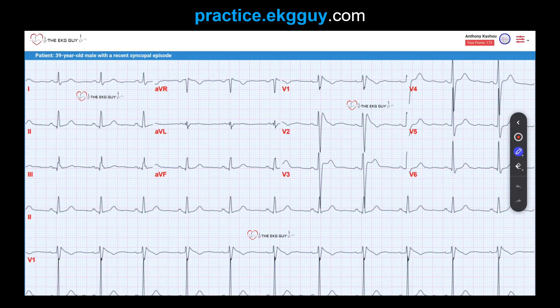So here we have an ECG from a 39-year-old male with a recent syncopal episode. First, notice the regular atrial and ventricular activity. Both were actually at a rate of 69 beats per minute. We'll see how to show and find that. There is a consistent AV conduction — no drop beats that we see here. Every P wave is conducted through to the ventricles.